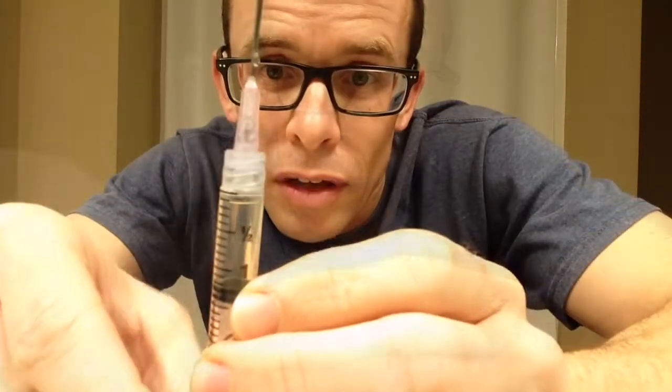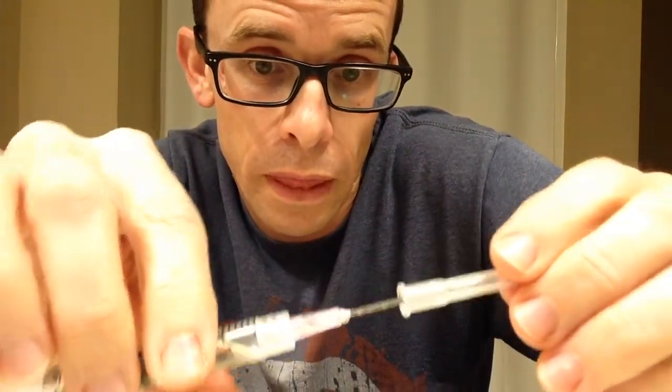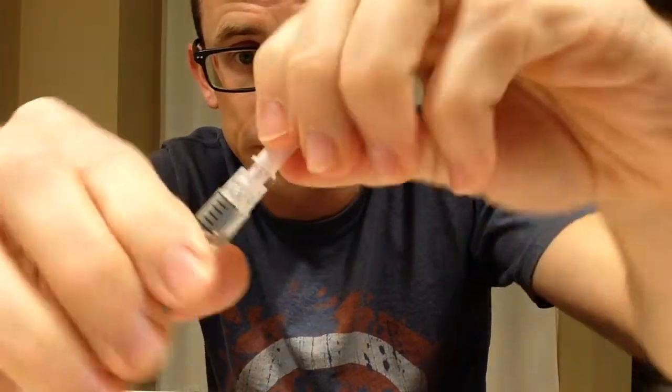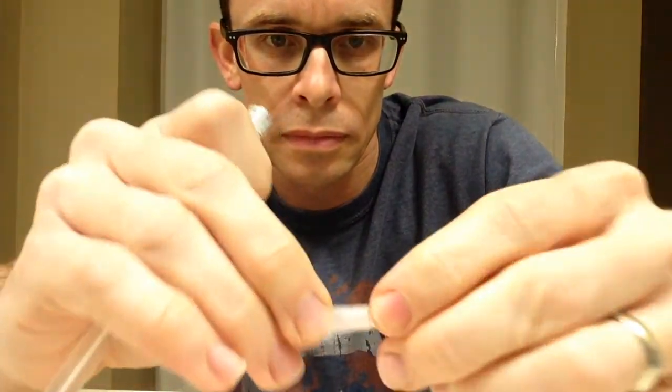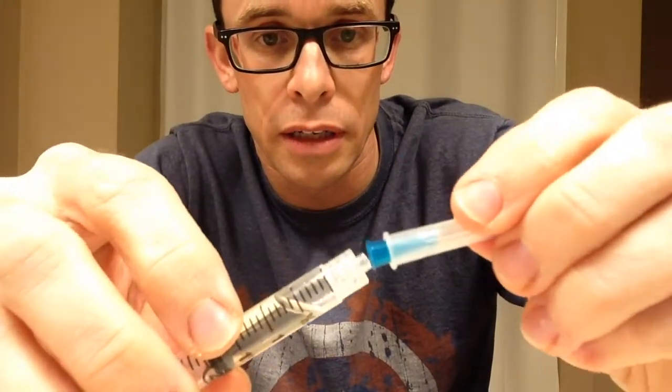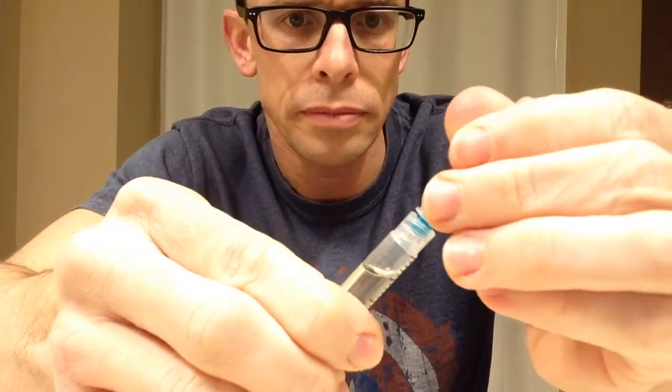Now, so you know what I'm actually going to do? I'm just going to pull that back in there now and make a big bubble, because who cares? I'm going to take this needle off anyway. This isn't the injecting needle, this is just the drawing needle. Put that back on, unscrew that, and it fell out. There we go. Now I'm screwing the injecting needle on. And I'm about to inject this. You're not going to get to see that part because you're not going to get to see my buns.